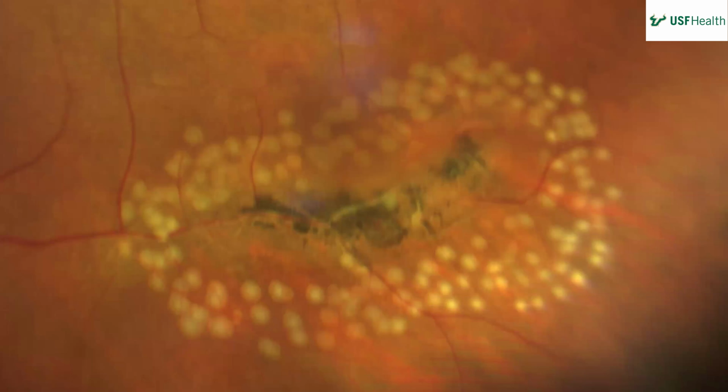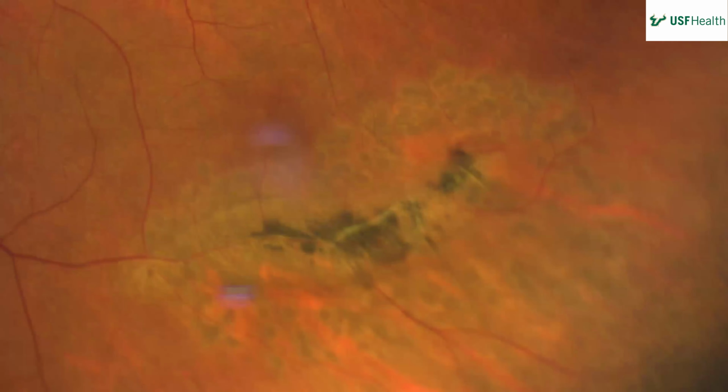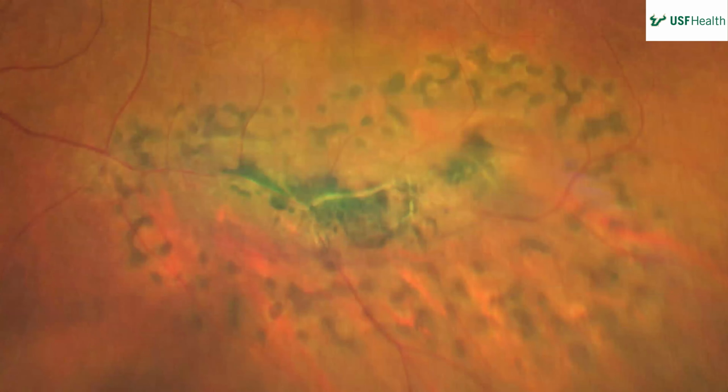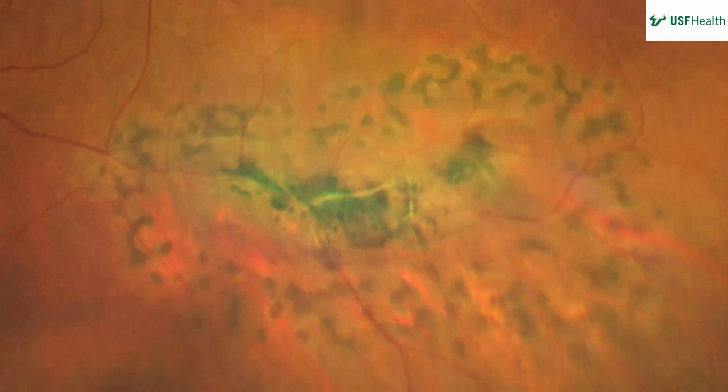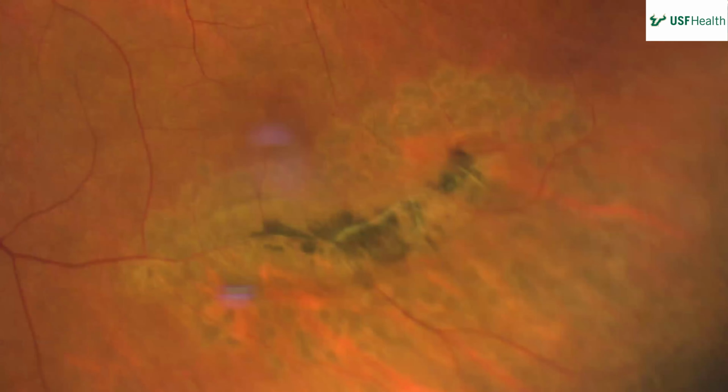It's same day, then 2 weeks and 3 months later. So here's that same day, and 2 weeks, and a few months after that. It's interesting because the laser spots go from light to dark, so there's this in-between time where you can't see them. It can be a little stressful, especially if it's not your patient. You guys see each other's patients, so you're looking at somebody and you think, did they get the laser or did they miss it? That middle one can drive you a little crazy. So you just have to have faith in your partners.